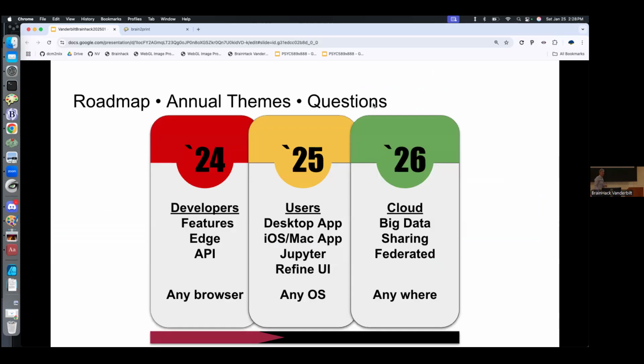We're on a 3-year mission supported by the Brain Initiative. Bad news, Brain Initiative last year got a 40% cut. So this may be the end of a 3-year mission, but we're 1 year through. Our first year, our goal, we called it any browser. We really wanted to show edge platforms, and engage a lot of the low-level developers who had a lot of experience of these are the core tools that their users needed and what was the API they wanted.